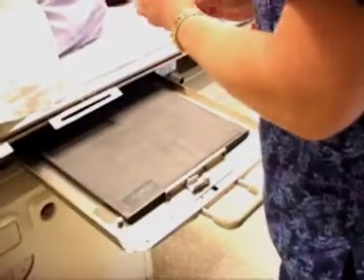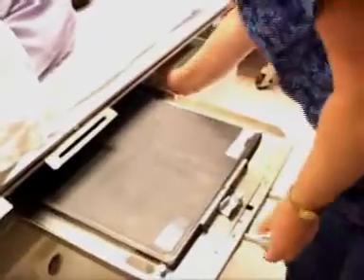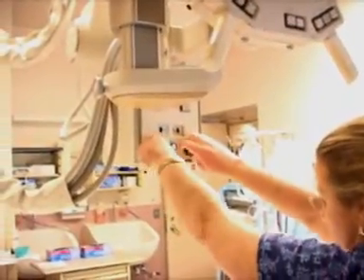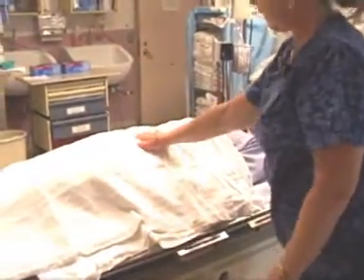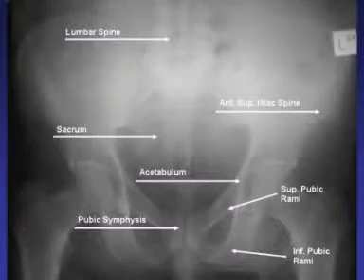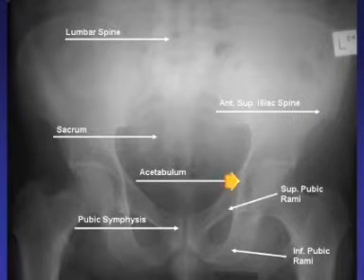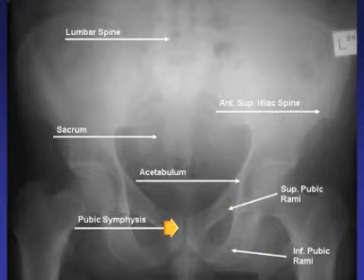The next important films are pelvic X-rays. AP pelvic films are important to ascertain injuries, especially after high-energy trauma such as a fall from height or high-speed MVAs. They can be helpful as adjuncts to ascertain areas of hemorrhage, since pelvic fractures can be associated with significant retroperitoneal bleeding. There are various anatomical structures visible in a normal pelvic X-ray: the lumbar spine, the sacrum, the anterior superior iliac spine, the acetabulum, the superior and inferior pubic rami, and the pubic symphysis.